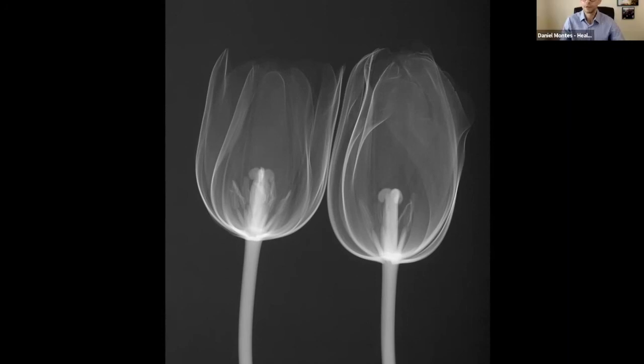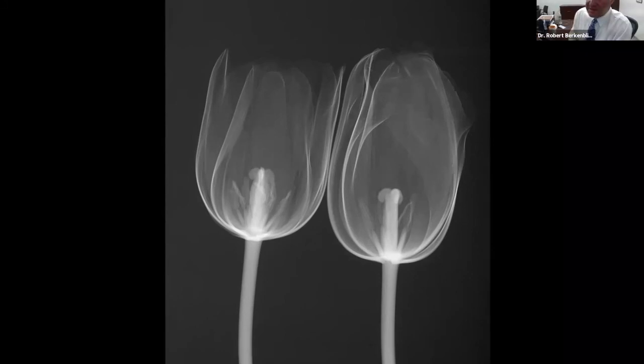Okay, thank you so much, Dr. Berkenblit. We're getting a third question. What is your typical CT protocol for the adrenal glands? Well, typically, if we're doing a washout study, we'll get a non-contrast set of images, then use standard contrast, roughly 120 mLs of contrast, with images at 70 seconds, and then we get a 15-minute delay.